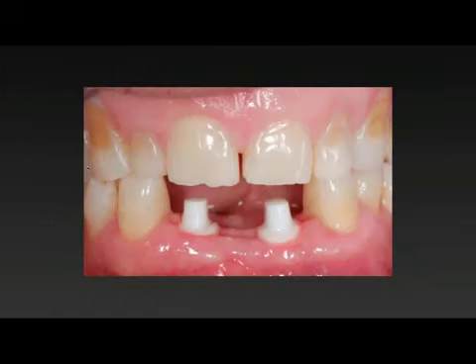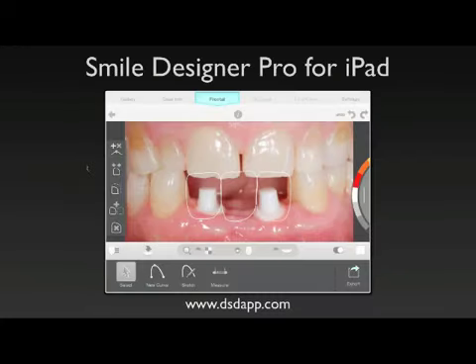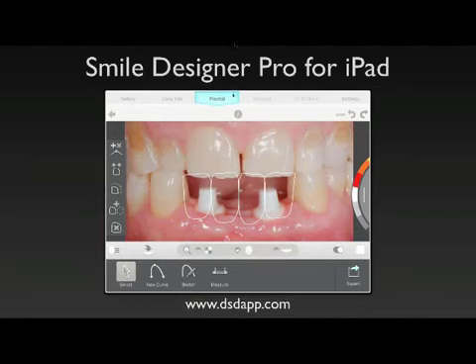These are the implants healed, and we ran into a problem. The positioning of our implants was such that we were too close to the midline, so we had a decision to make. Are we going to put 3 teeth on this and have perhaps a more stable periodontal prognosis, easier to clean, easier to maintain, easier for the laboratory to fabricate the final prosthesis, or are we going to do 4 teeth and try to design around these abutments?